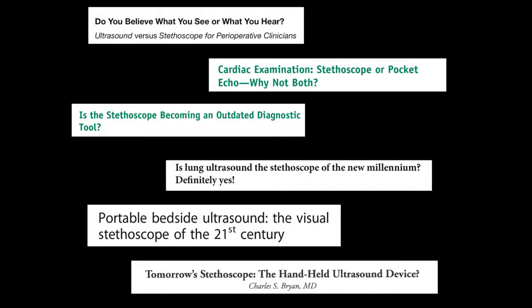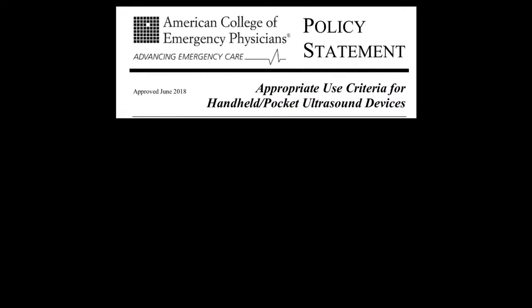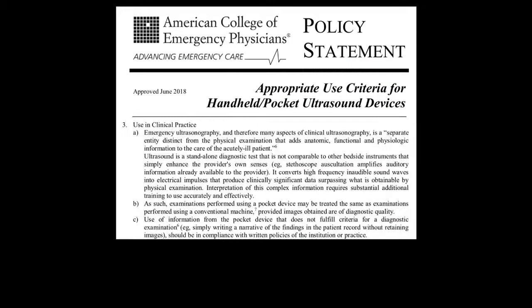These portable ultrasound systems are making this so affordable that they want you to integrate it with your physical exam. And that's not the right answer that we are trying to give to the population, right? This is another adjuvant that you want to use for taking care of your patients. Okay? So again, more data coming out of there.